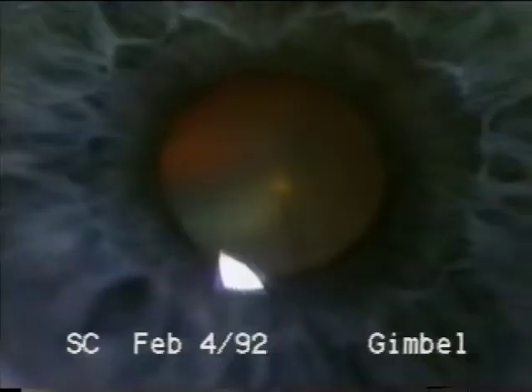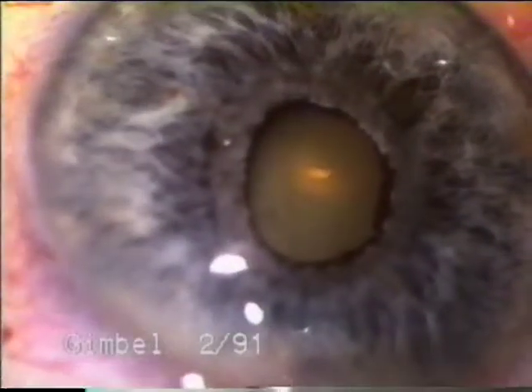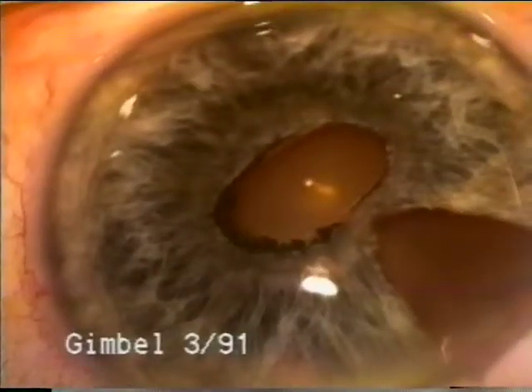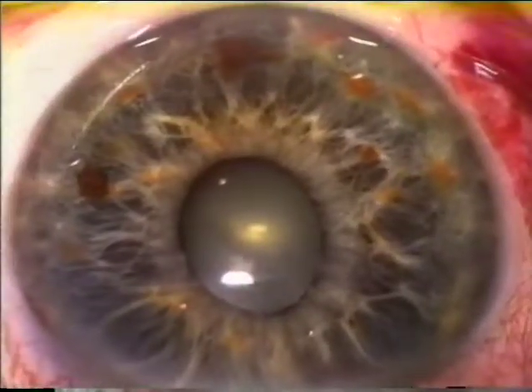When faced with a pupil of five millimeters or smaller, many surgeons hesitate to perform phacoemulsification due to the difficulty of visualizing the anterior capsulotomy and the risk of posterior capsule tears.